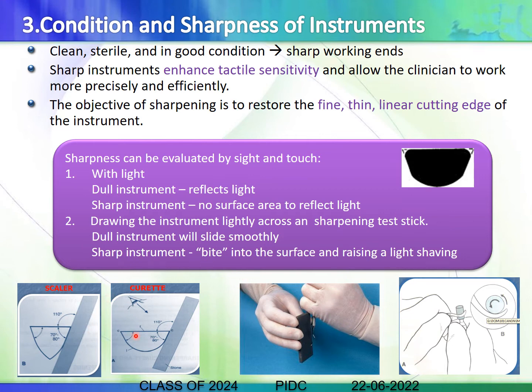Generally, you do have sharpening instruments, either the stationary ones or the mounted devices for sharpening your instruments.